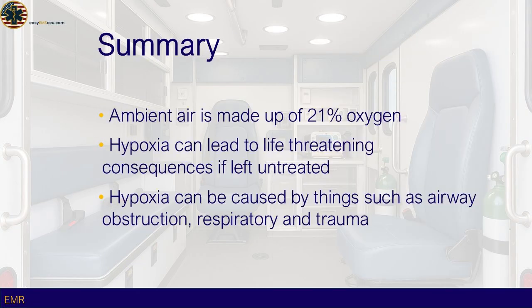situations. Oxygen therapy is a critical component of EMS, ensuring adequate oxygenation for patients in respiratory distress, trauma, or cardiac emergencies. Ambient air contains 21% oxygen, which is usually sufficient for healthy individuals, but hypoxia can lead to severe complications requiring immediate intervention. EMS providers use various oxygen delivery methods, including nasal cannulas for low-flow oxygen, non-rebreather masks for high-concentration oxygen, and bag valve masks, BVMs, for assisted ventilation.